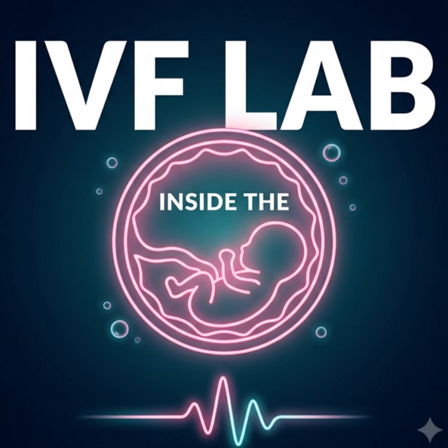Okay, so we've established that time-lapse gives us a massive increase in visual data, thousands of pictures instead of 3. But here is the piece that feels incredibly counterintuitive to me. Getting all of this extra visual data actually requires less physical interaction with the embryo. You get more by doing less. And this is perhaps the single most profound biological benefit of the technology, and it's often completely overshadowed by the flashy videos. Really? Yeah.